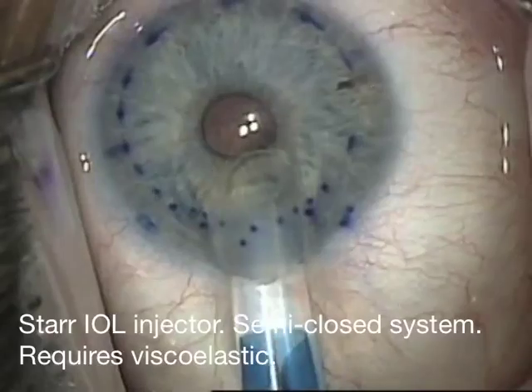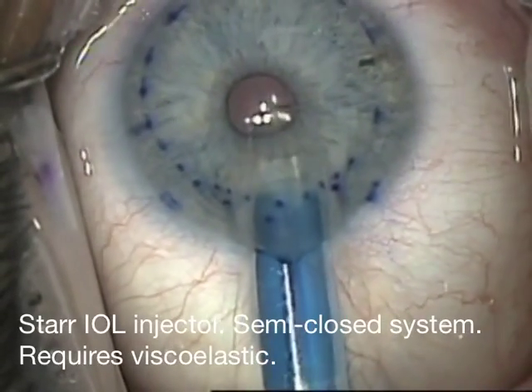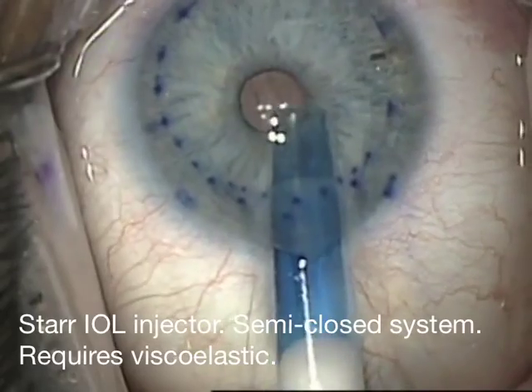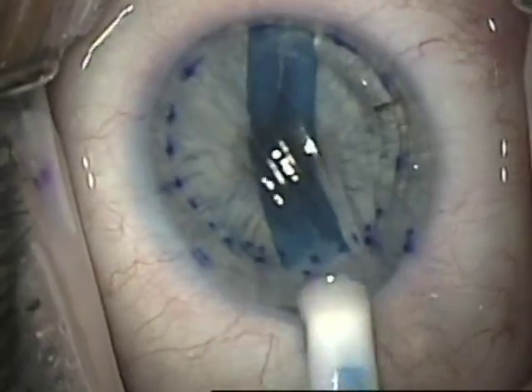Many of the current injectors don't meet these criteria. For example, this is the Star IOL injector. It's only a semi-closed system and it does require viscoelastic. It can be difficult to inject the graft, can get viscoelastic in the eye, and the foam plunger can damage the graft.